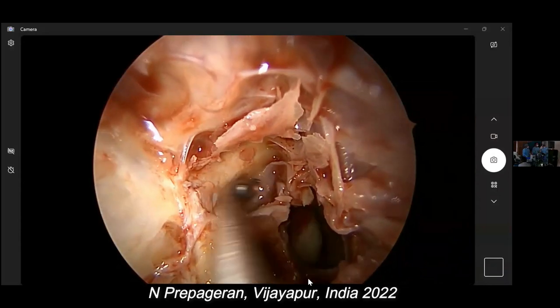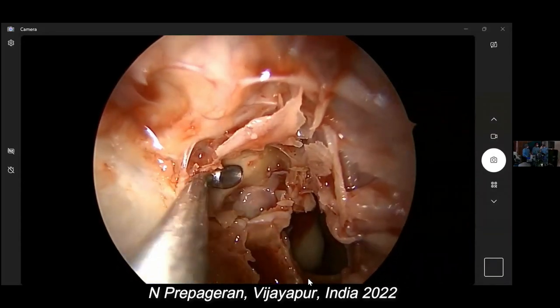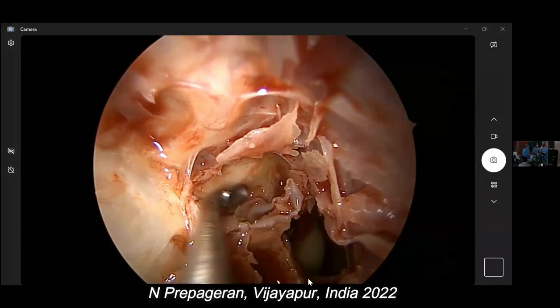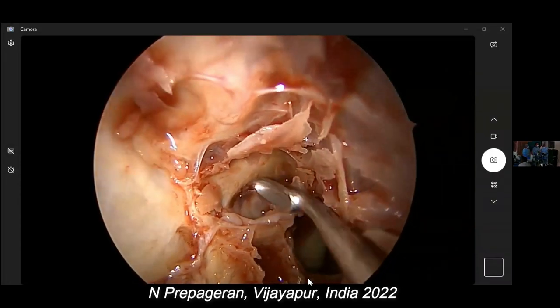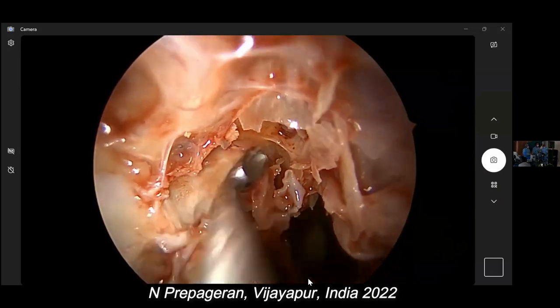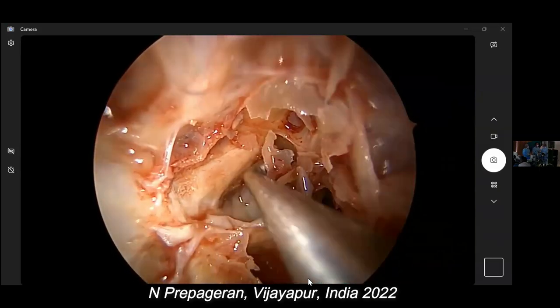Keep surgery simple. Life is complicated enough, especially when the income tax or your IRB sends you a letter. So keep surgery simple. Do a decompression until you are able to see, decompress all the way up to the opticocarotid recess. Can you see, guys? Yes, sir. Okay.